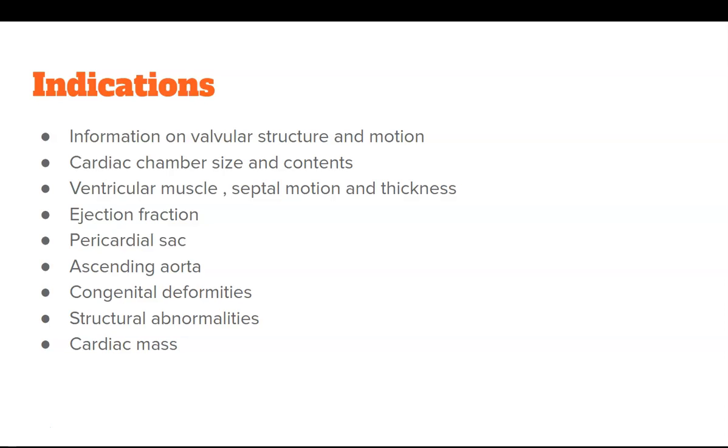The thrombus may break up into pieces and move wherever it wants. If the thrombus is in the right atrium or right ventricle, it goes to the pulmonary artery, causing pulmonary embolism. If the thrombus is in the left side of the heart, it goes into the systemic circulation. The most immediate circulations are the coronary and cerebral blood circulations. Echocardiography helps us visualize those things inside the chamber.